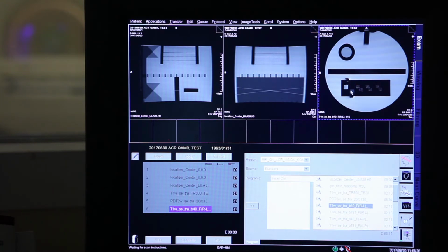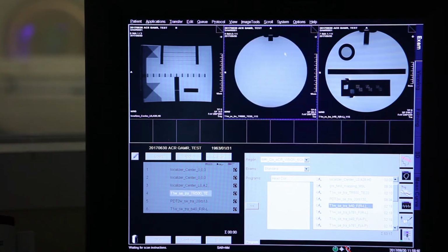Important also to mention is that from the difference in the bandwidth, you see the distance between these 2 points. If you go in a standard, let's say, medium bandwidth sequence, which is this T1 weighted, that's why we took that image, at the specific slice, you see that these structures here, actually they are really close to one another. This is fat and this is water. I told you that this phantom is really very wisely designed. So with one slice you can have everything. You can see slice thicknesses, spatial resolution, but the important thing here is that you can check the bandwidth of the sequence if you measure the distance of the fat and water. With a low bandwidth sequence, which is here, this distance is increasing. And this is something which has been described in the literature.